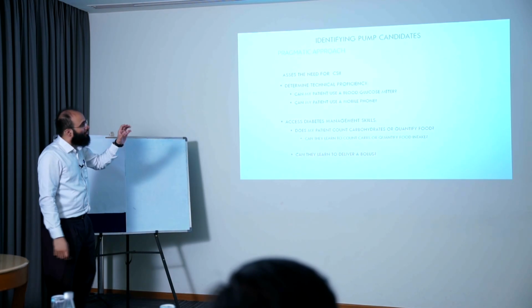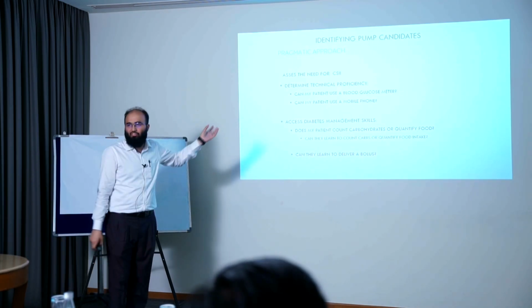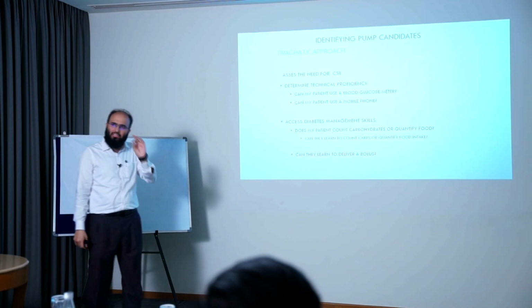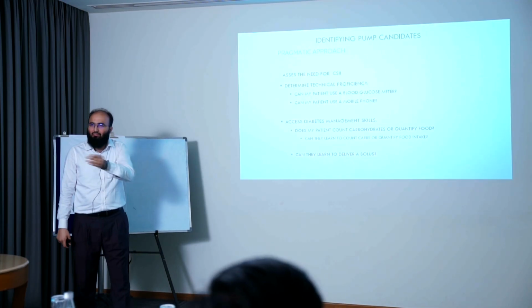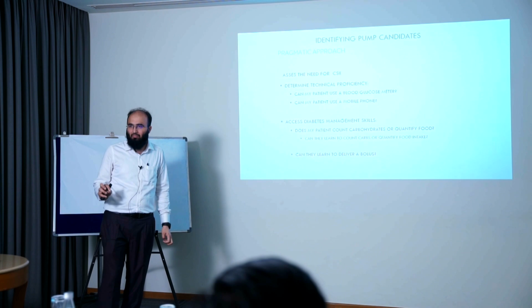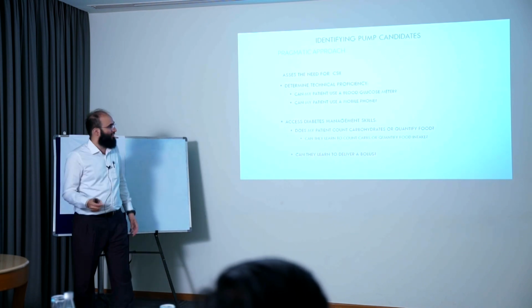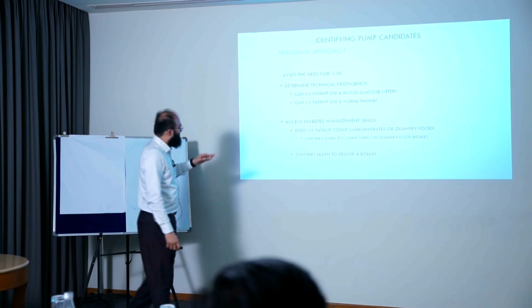And can my patient use a blood glucose meter? Can my patient use a mobile phone? To assess the technical proficiency of the patient, ask him, "Do you know how to check sugar?" "Yes doctor" or "No doctor, my daughter does it." Oh, it's a red flag. Maybe it's going to be difficult for him. There has to be one person who constantly takes care of his pump if he is put on that. Can my patient use a mobile phone?